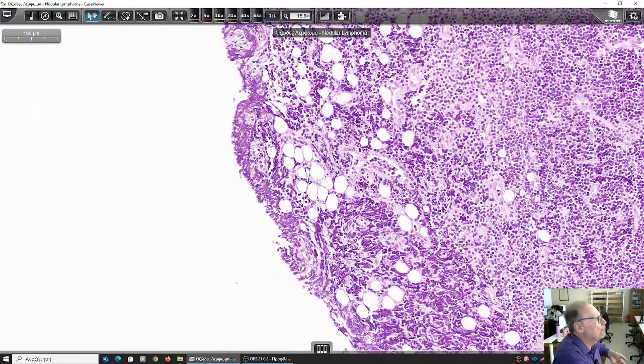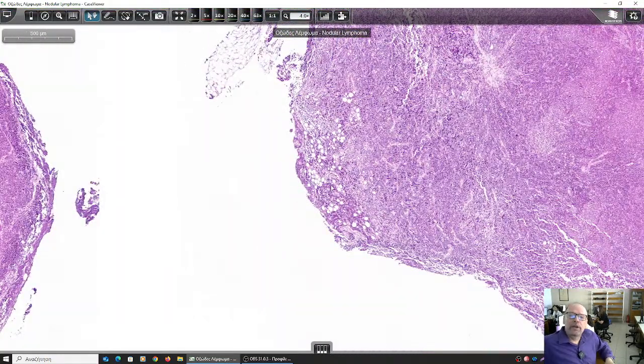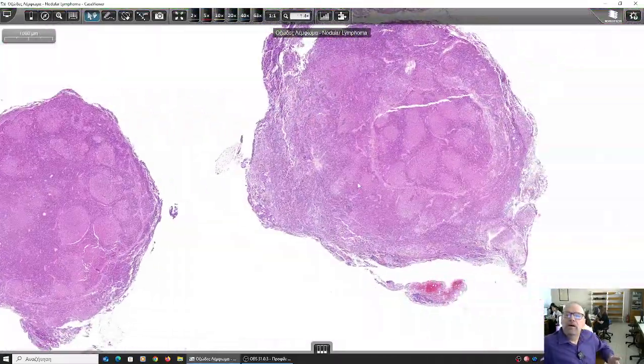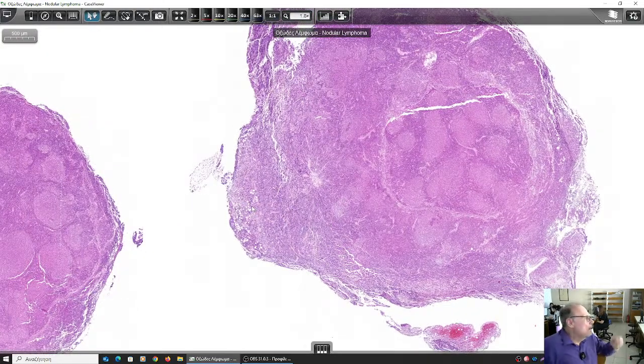What's wrong with them? If these are cells from the surrounding tissue of the lymph node, is there something wrong with them? Have a look. What are these other cells doing here? The other cells, these ones, the dark appearing cells, we say that this may be the lymph node, all right? It looks like it. We'll see what structures are within the lymph node next. This might be the surrounding fat tissue. And what are all these cells doing here? What might you suspect if you see that?